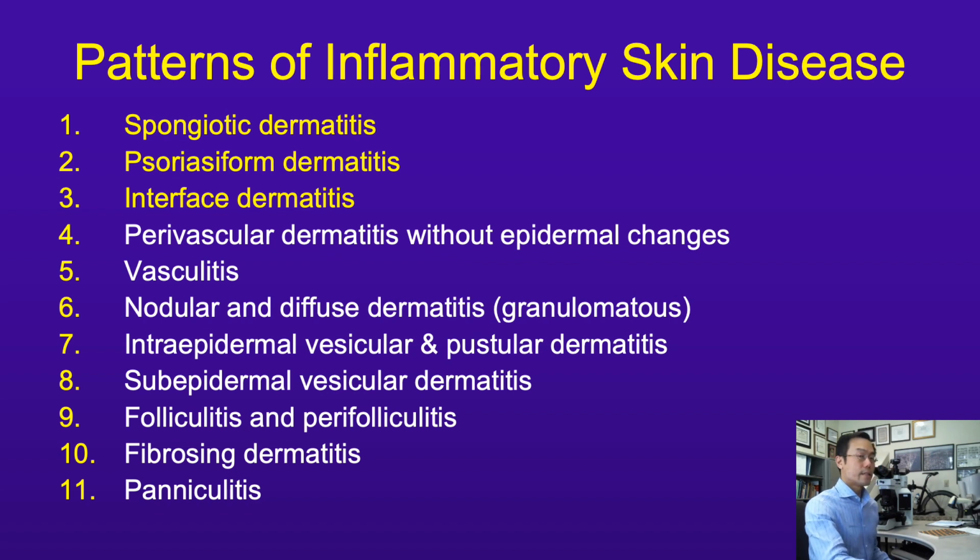Turning our attention now to inflammatory skin diseases, we can see that there's nearly a dozen patterns of inflammation recognized in the skin that form the basis for microscopic interpretation. For today, we're just going to go over perhaps the prototypical example of the first three patterns. The rest of our 18-month curriculum includes 2-hour teaching sessions on each of these topics.